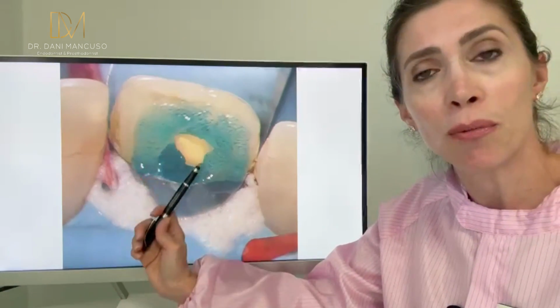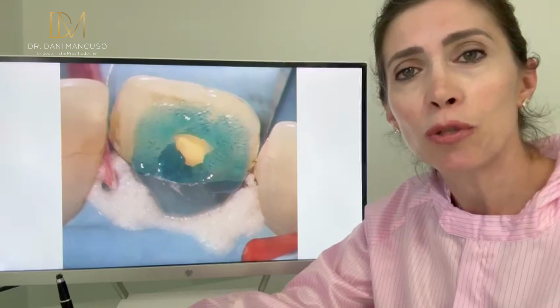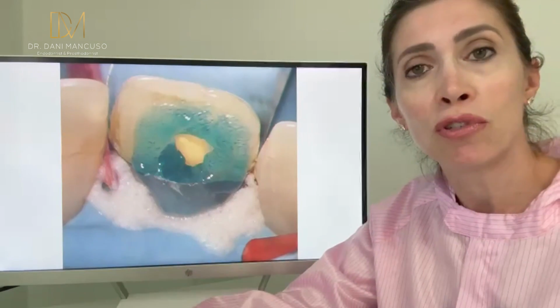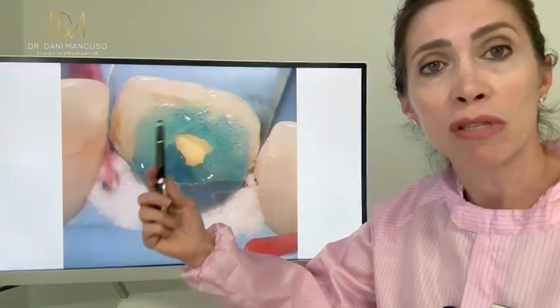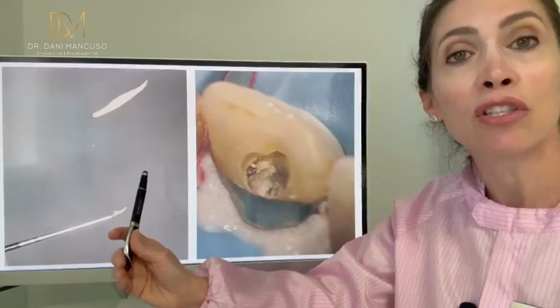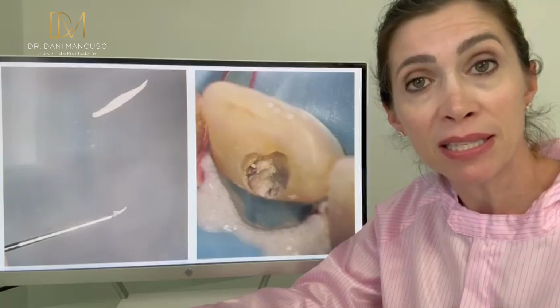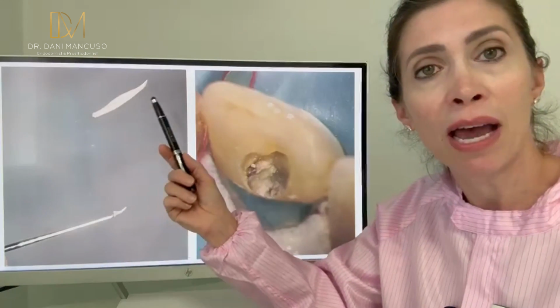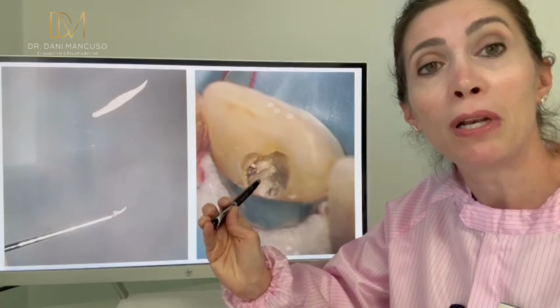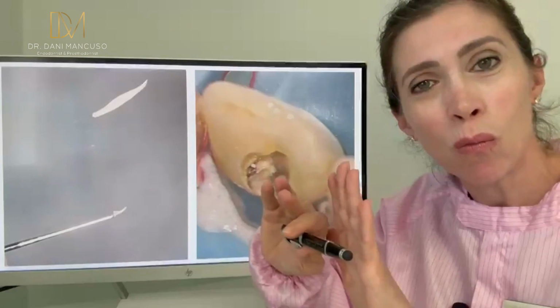So before you put your putty, etch the external part of the tooth. It depends on which bonding system you are using. I use the 3-in-1, so I will do a selective etch. So select the enamel and etch the enamel. And then I'm going to do the application of my bioceramic putty. Roll that as if you have a snake, and you can get just a tiny piece and just plug in where the perforation is and just try to rebuild that wall.